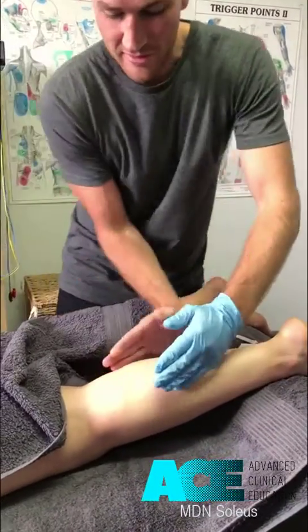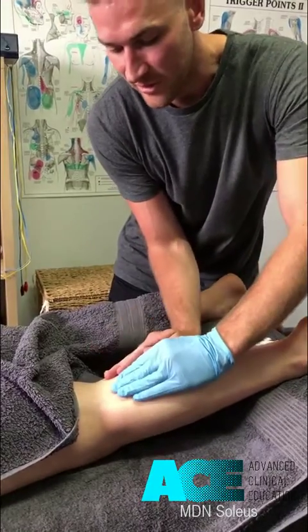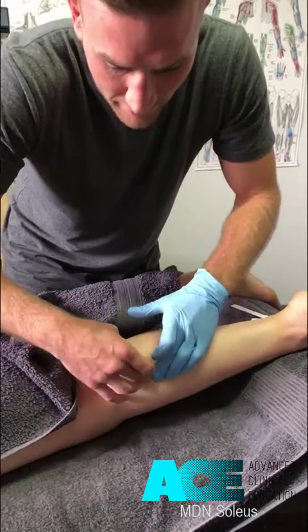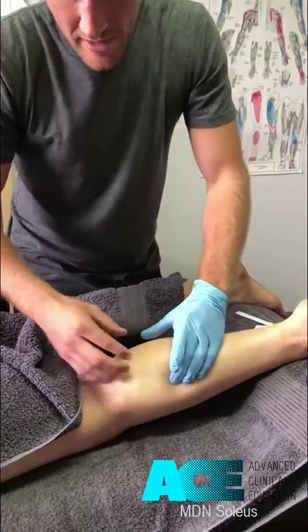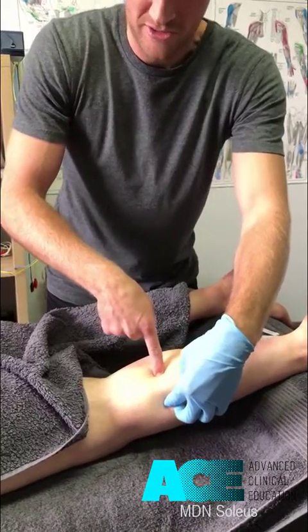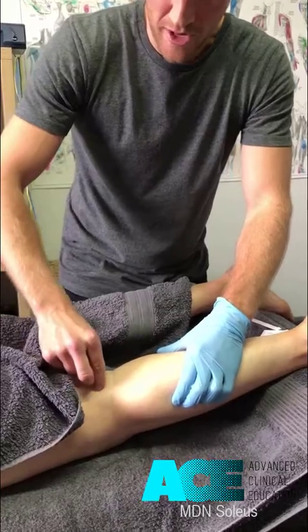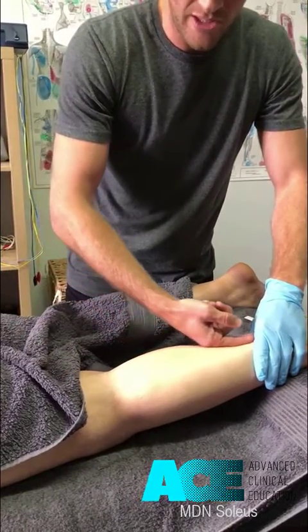Importantly, this muscle is really quite broad. The gastrocnemius is sitting on top, and just lateral to that we've got our fibularis muscles, so we want to make sure that we do stay in soleus. The angle of approach we're going to look at here comes in laterally so we don't disturb the gastrocs, and we also need to be aware of the neurovascular structures running really deep through the posterior lower leg.